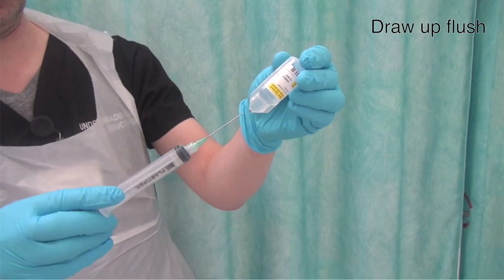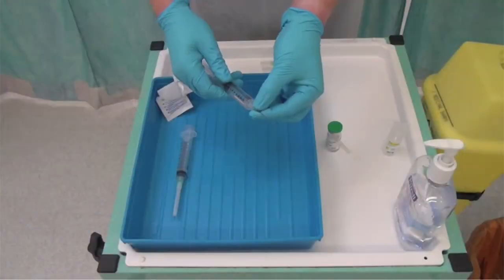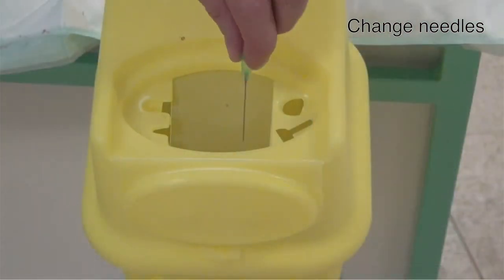Draw up your flush, then change the needle at this point to avoid resheathing it.